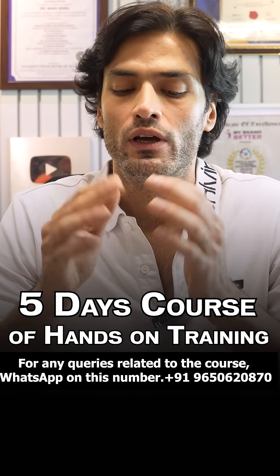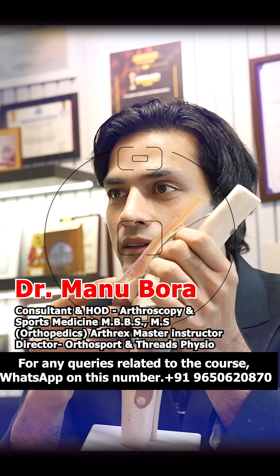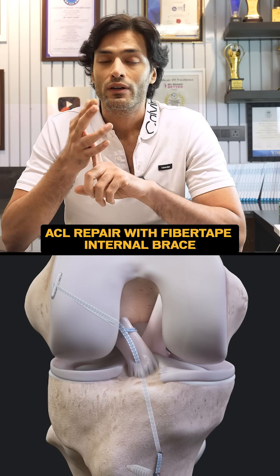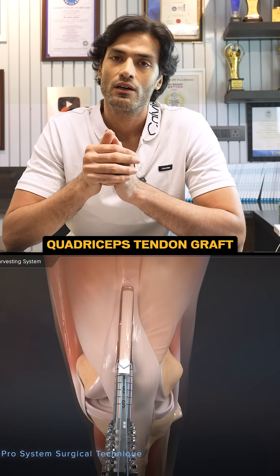What are we going to do? We are going to teach you each and every step about the ACL surgery — what is all inside, what is ACL reconstruction, what is ACL repair, what kind of grafts we can use. We will be focusing more on quadriceps tendon graft with the QuadPro, because that is the strongest graft.